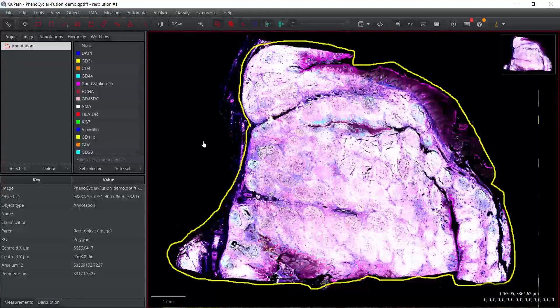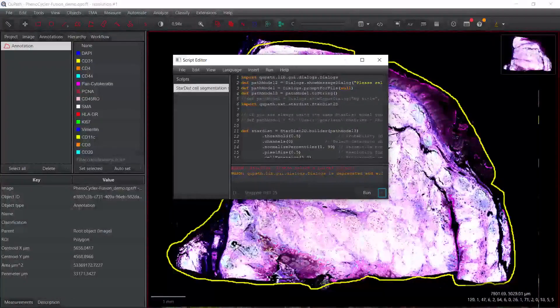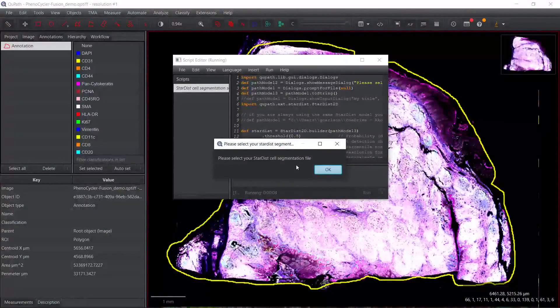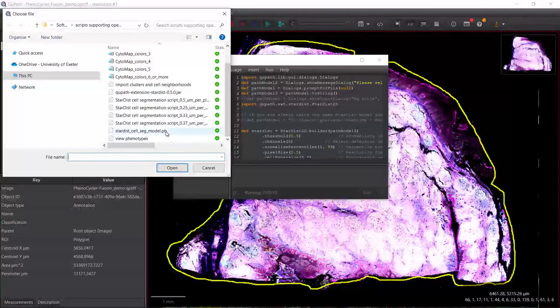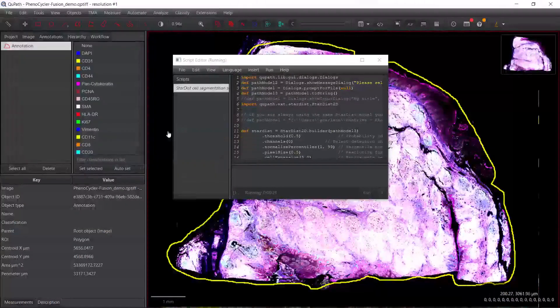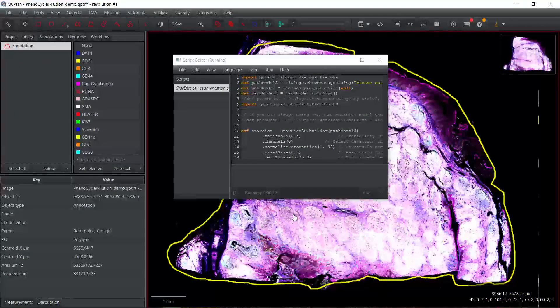So for today's demonstration, I'm going to use the StarDist method to perform cell segmentation. First, we need to drag and drop the cell segmentation scripts for the 0.5 micrometer scripts. We can press run. You can see QPath asks us to find the segmentation model. We can press OK. Now we can select the model. We can press to open. Now QPath is running to perform cell segmentation. This takes half an hour for the whole tissue.